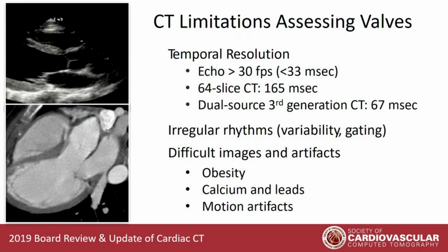Speaking of temporal resolution, these are the things about cardiac CT that make evaluation of the cardiac valves a challenge. When you think about the temporal resolution of echocardiography, 33 milliseconds, the best CT acquisitions that we have, giving up multi-sector reformations and things like that, honestly, real-time, true temporal resolution of CT, you're not going to do much better than 60 milliseconds. So echo is clearly the winner there.